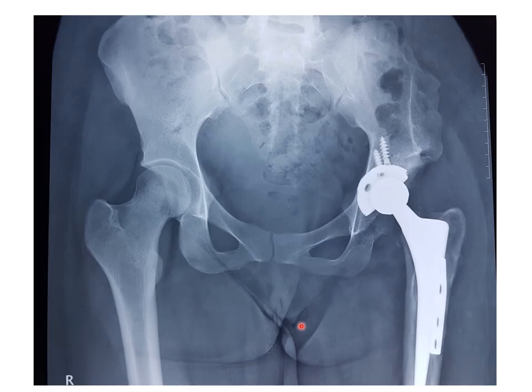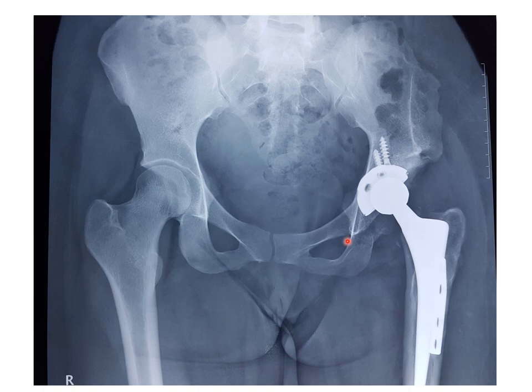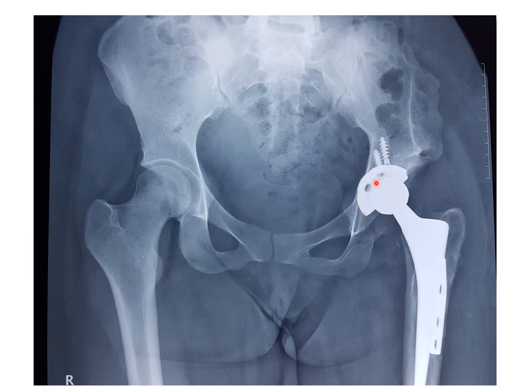We waited one to two months to allow the wound and bone to heal, then started the operation as planned. We did the exposure, released some of the abductors at the greater trochanter, released the iliopsoas from the lesser trochanter, and reamed only in the lower part of the acetabulum at the original site, using a rather small cup — we couldn't make it larger without excessive pelvic penetration, so we were satisfied with this size.